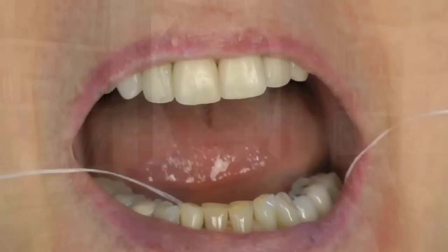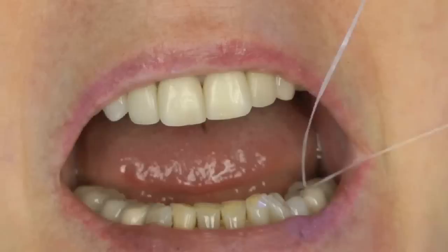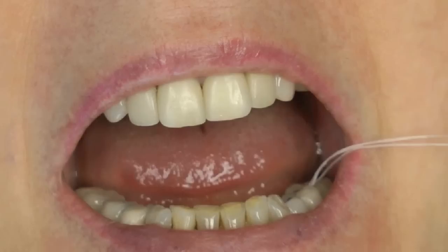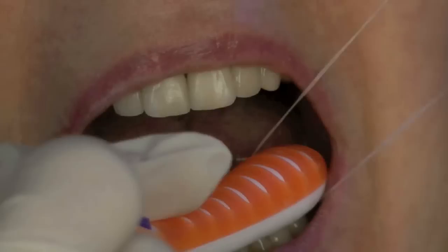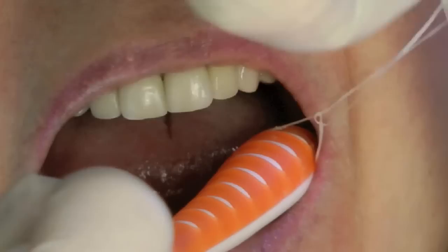What I've done is thread some floss through the contacts of the two splinted restorations. I'm tying a knot so that the floss is connected to those two restorations. You can see how wiggly they are. Now we're going to take a toothbrush — I find large diameter ones with that soft end on them very effective. We're going to tie the floss to that large toothbrush with multiple knots, because obviously one knot is simply going to slip.